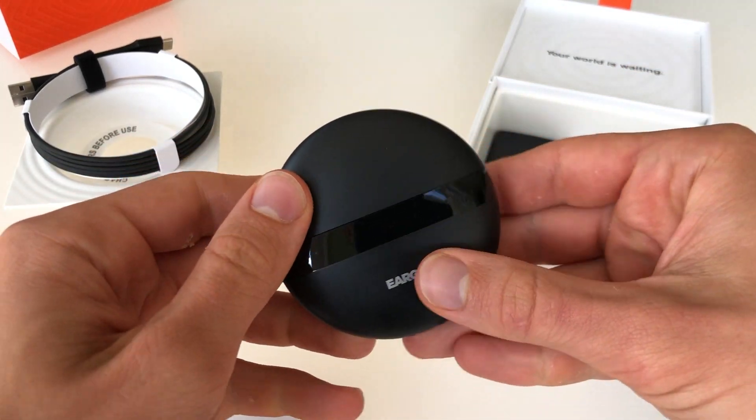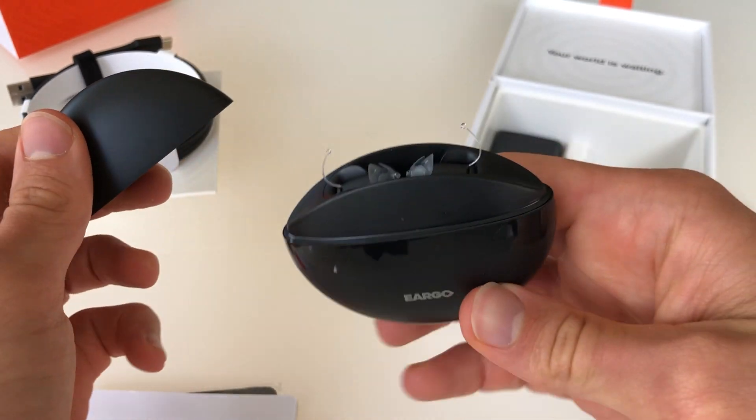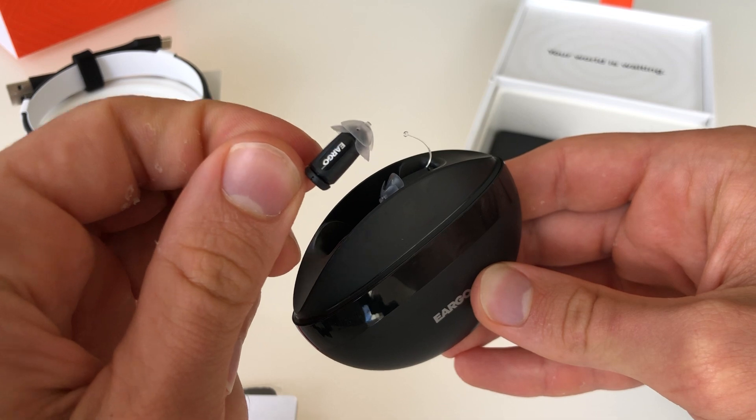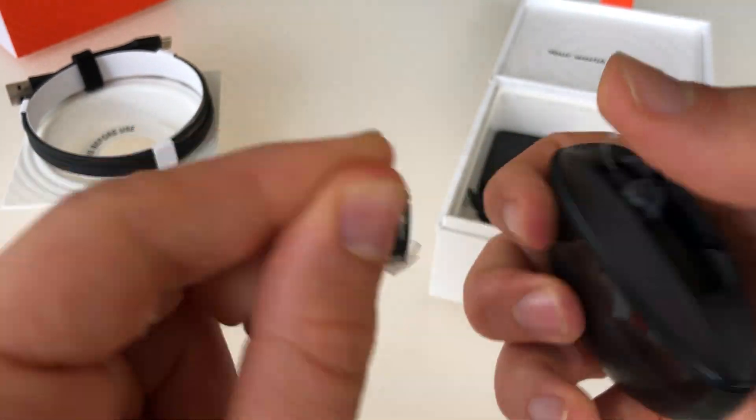Now, the moment we're all waiting for — let's open up this case for the hearing aids and see what's inside. There are the Eargo 5 hearing aids. You can see they're nice and small.